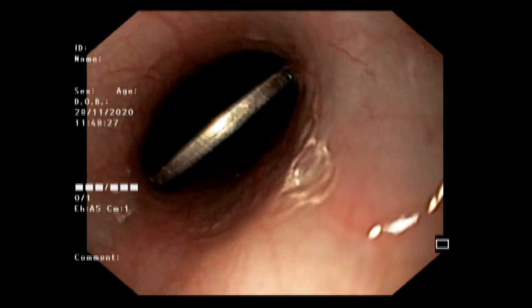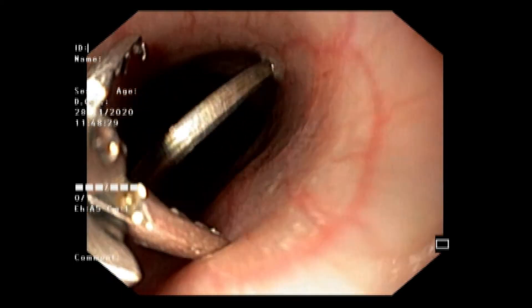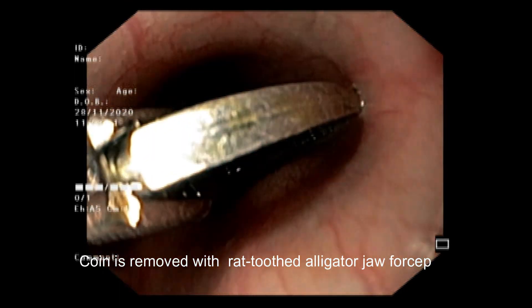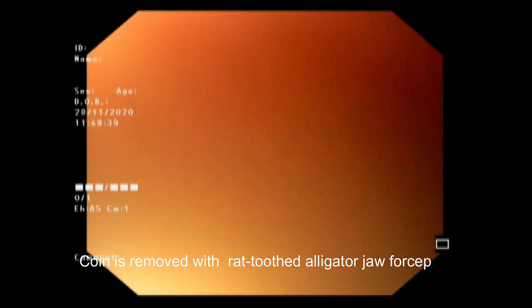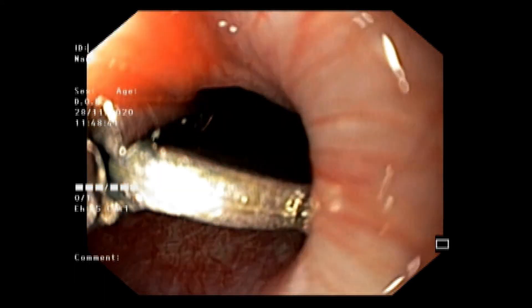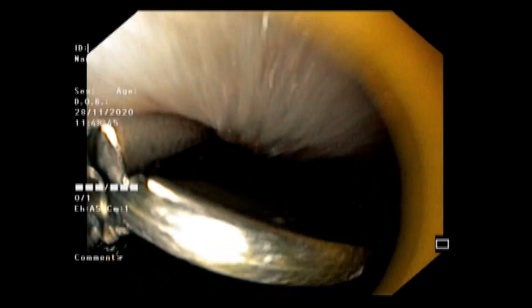We then passed the foreign body forceps to hold the coin. Holding the coin with the foreign body forceps, we removed it slowly and passed through the cricopharyngeal constriction. Despite feeling mild resistance at the cricopharyngeal constriction, we passed safely and the coin is now outside.